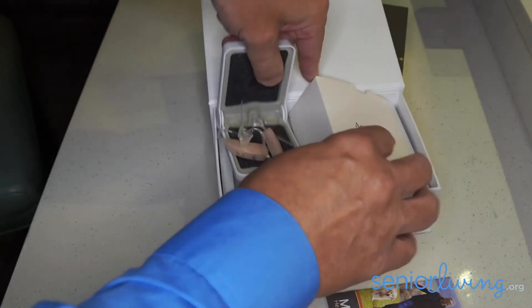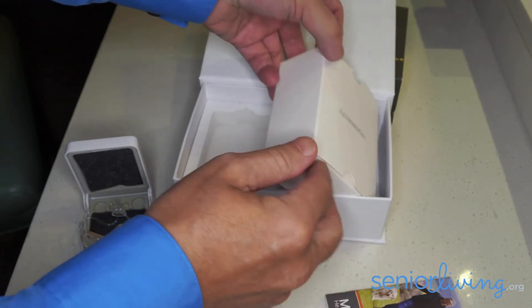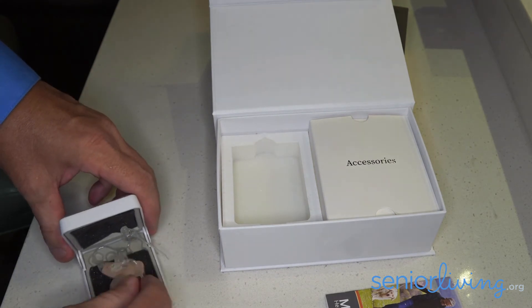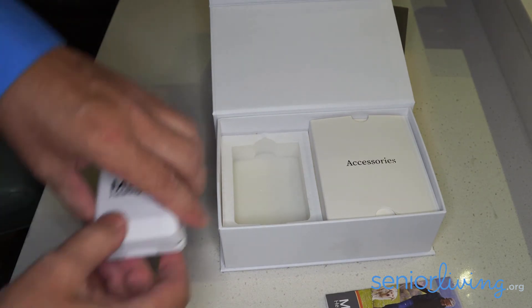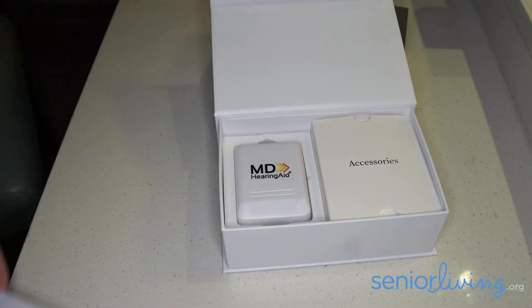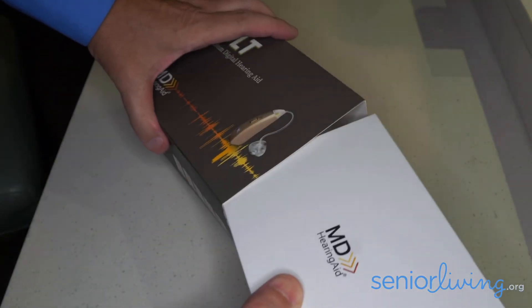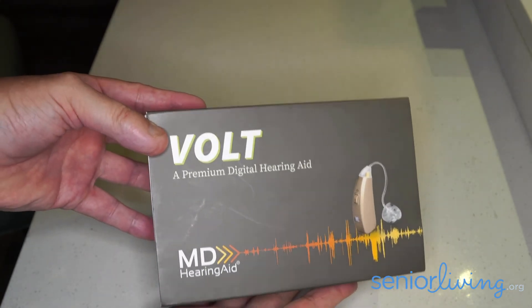So that's our quick unboxing of the MD Hearing Aid rechargeable Volt hearing aid. I'm going to pack that back up and I hope you enjoyed this unboxing and find the review on our website helpful.